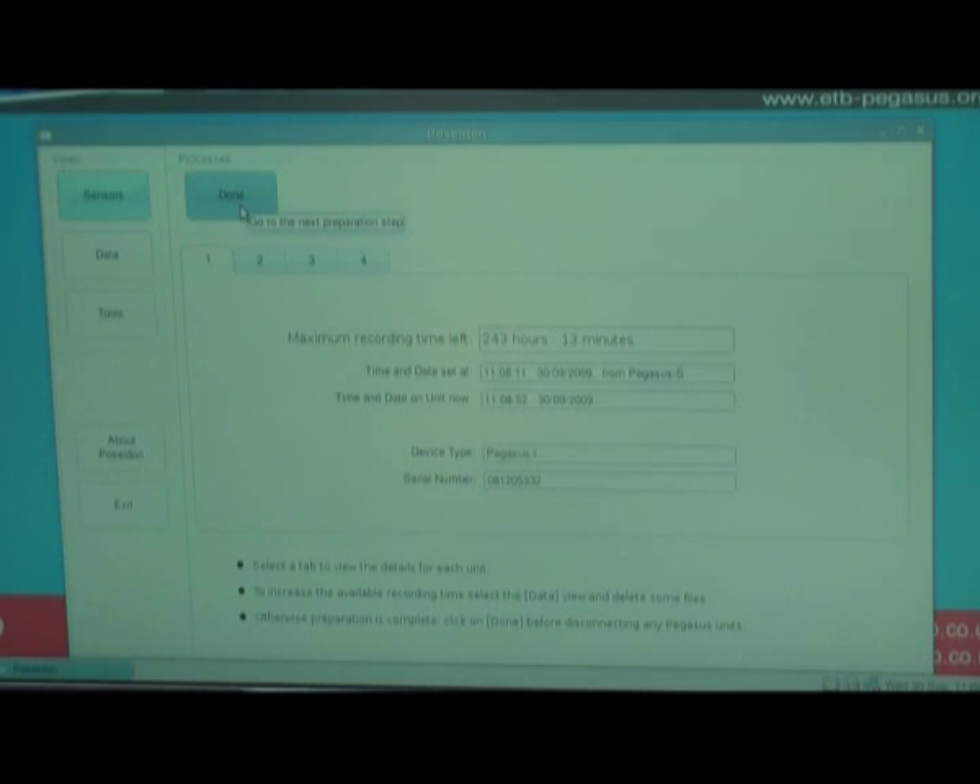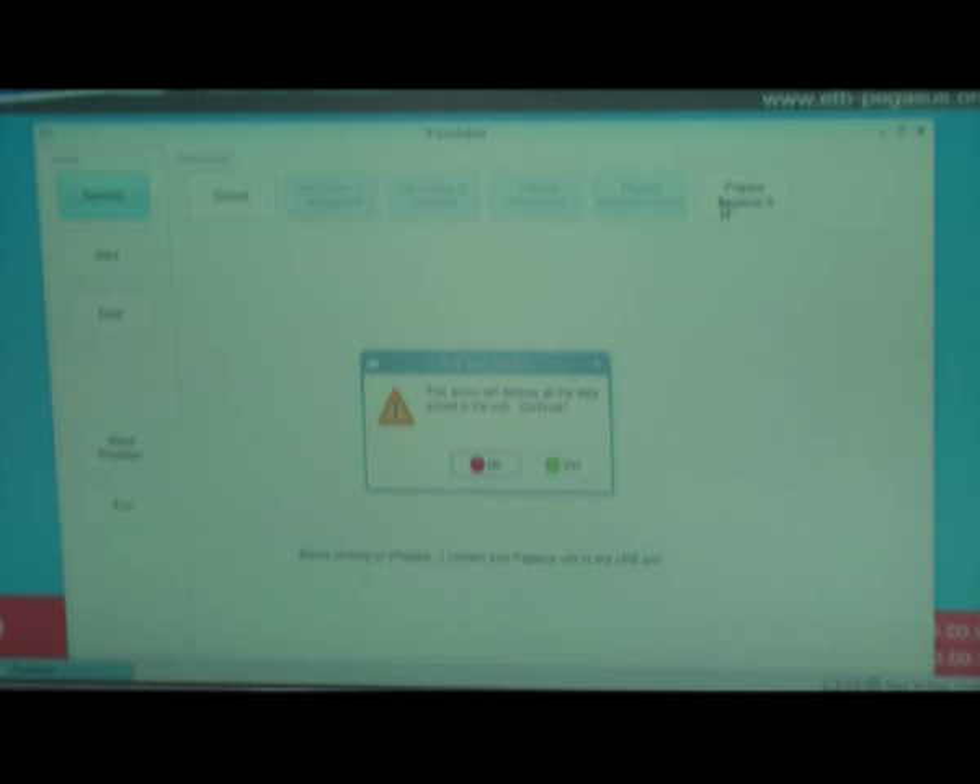Once I am happy with the maximum recording time left, I click Done and then say Prepare Pegasus S. It says this action will destroy all the data stored in the unit. Do I want to continue? I click Yes, and then Done. And that's the sensors ready to go do our profile.